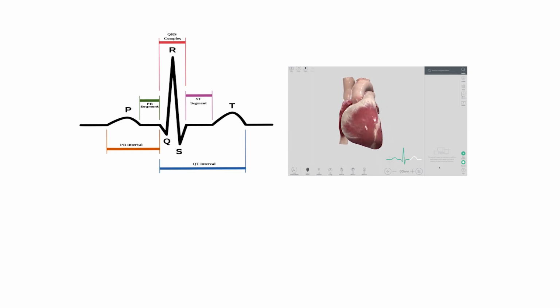Alright, so we're going over some EKG changes, and this is a normal EKG. The PR interval here is roughly around 0.12. Excuse me. Alright, so we've got here a regular PQRST EKG wave.